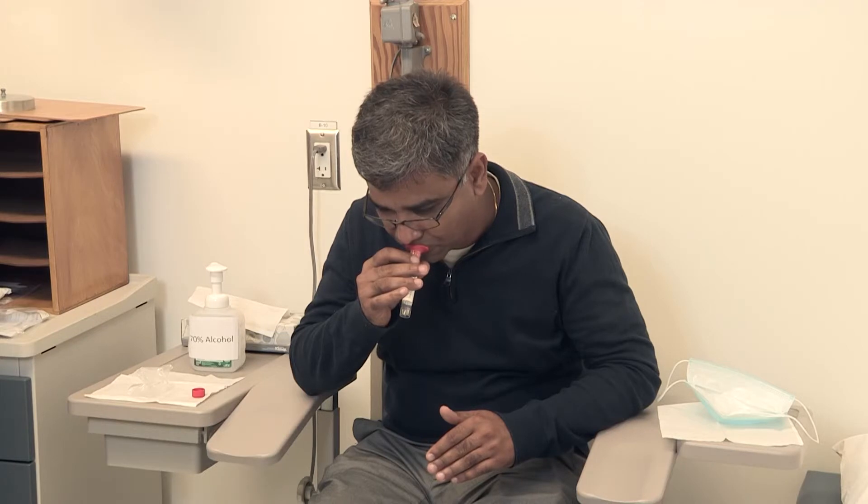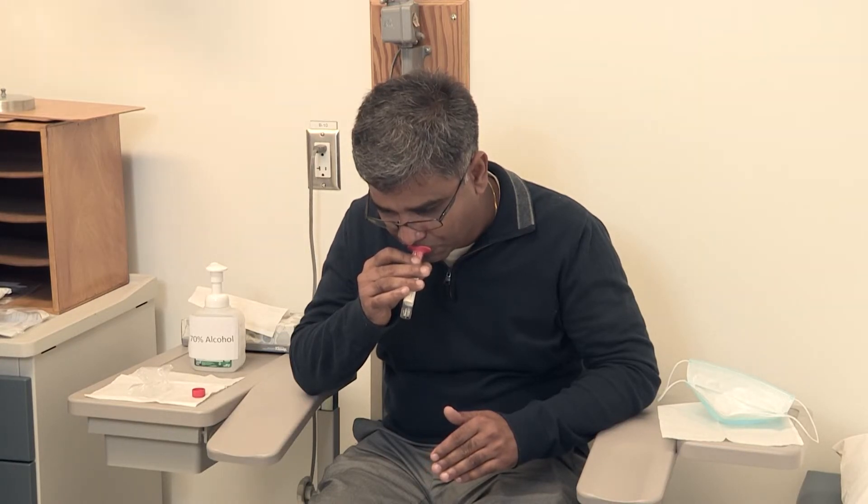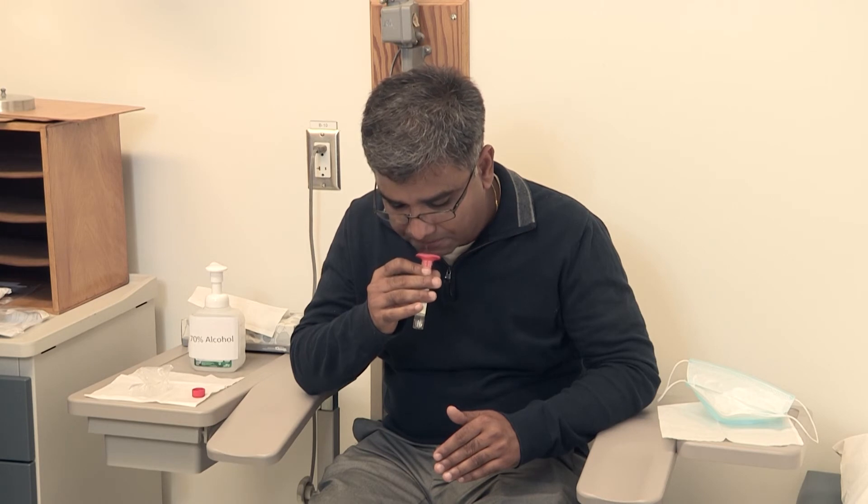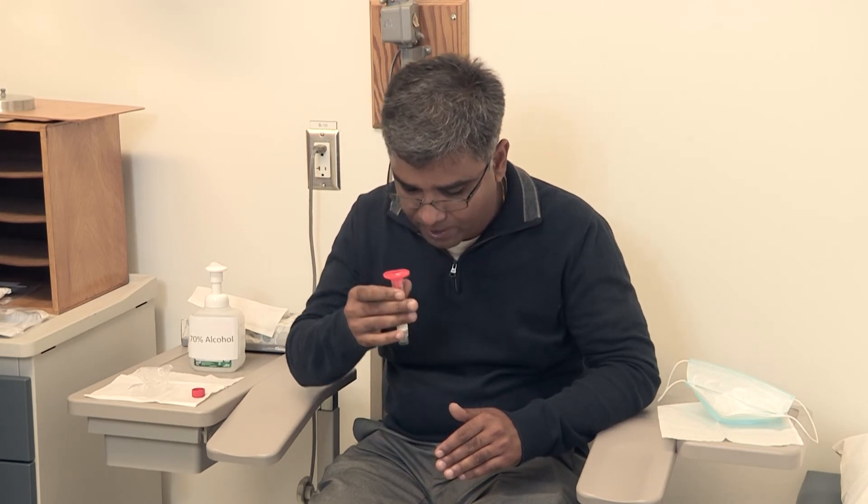To avoid splashing, spit carefully into the funnel or straw. Continue to spit into the funnel or straw until there is 2-3 milliliters in the tube. This may take several minutes.